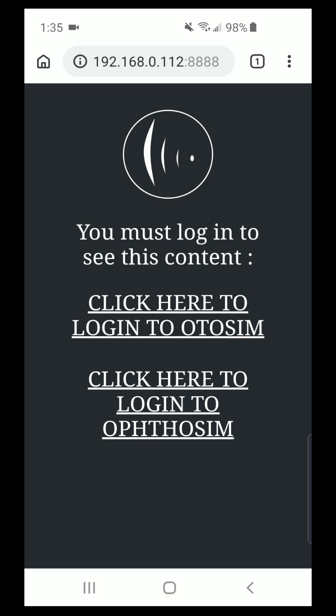On this screen, you'll see that you can either log into the OtoSim Mobile platform or the OphthoSim Login platform. In this situation, we're going to log into the OtoSim platform. But before we do that, we are going to create a homepage icon for this particular site.